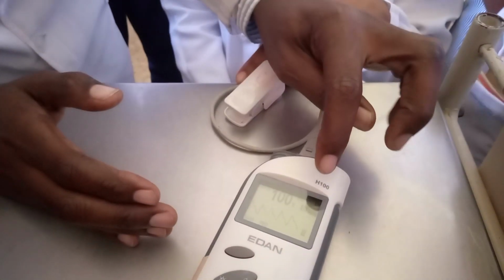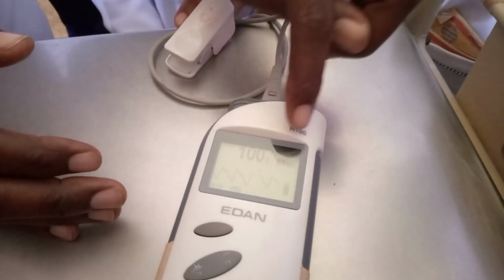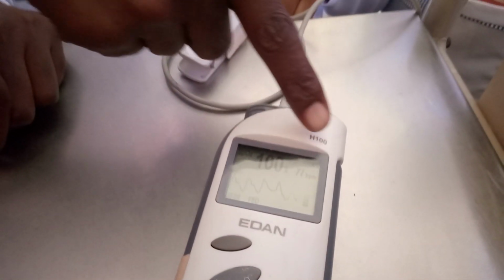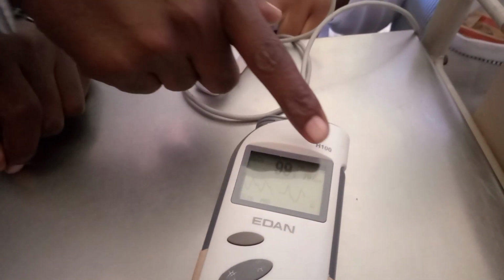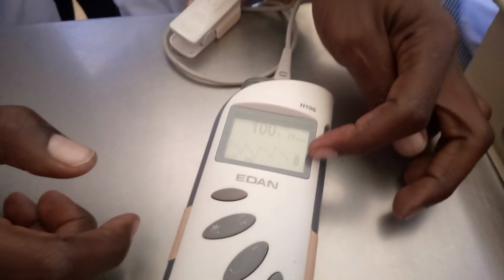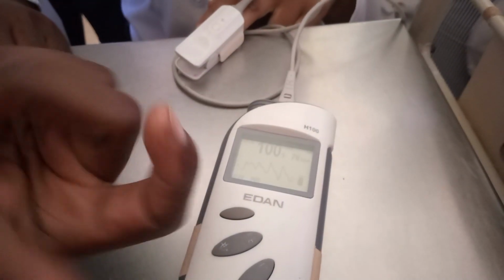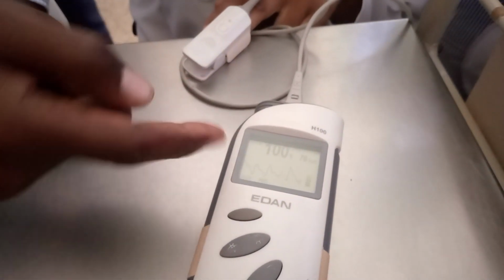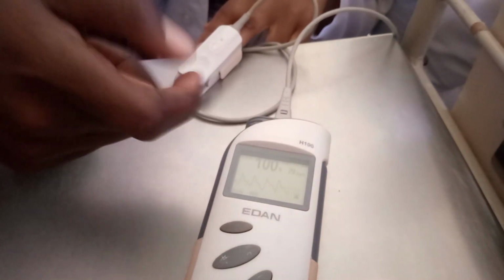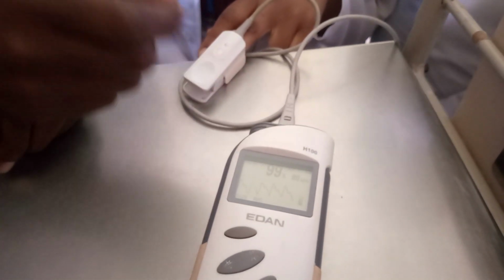Then, on the other hand, it will show you PR, which is pulse rate. It gives you the patient's pulse, which is 81 beats per minute, BPM. This here indicates that there is a pulse; it's pulsating, showing the strength. The waveform, as I said, shows how the intensity of light goes through the skin to find an artery so that you get these readings. This is how the pulse oximeter works.